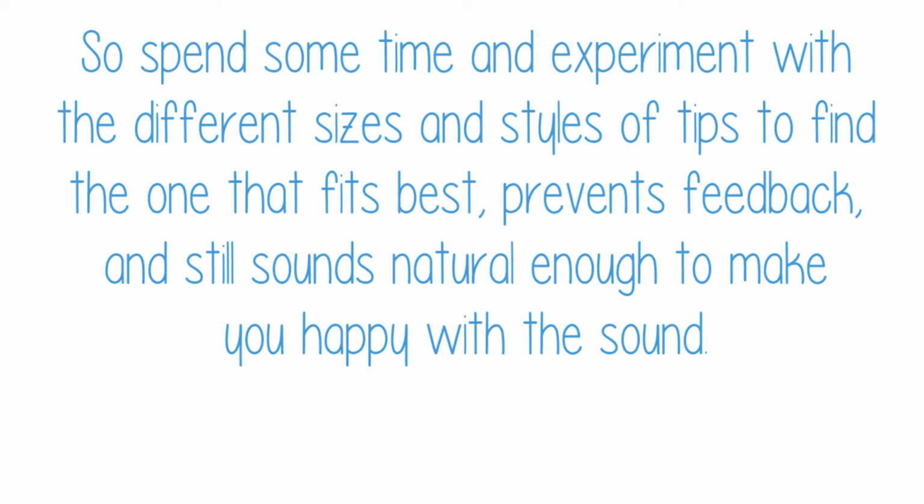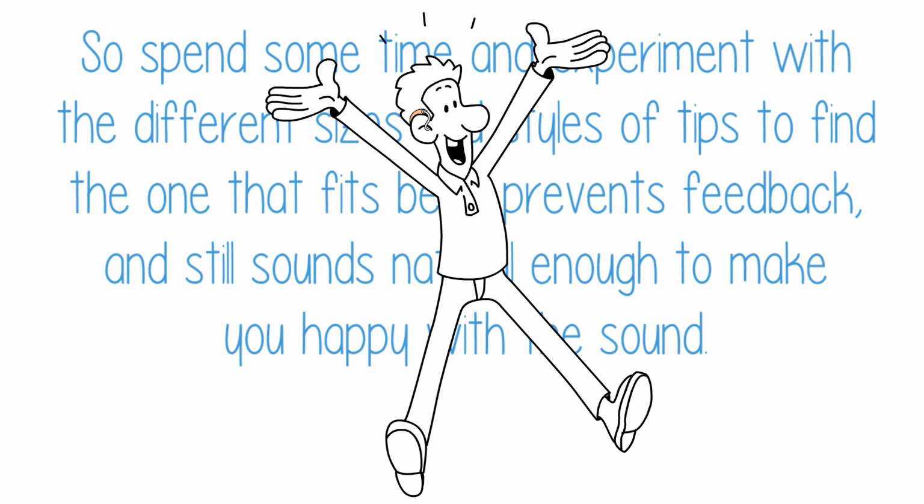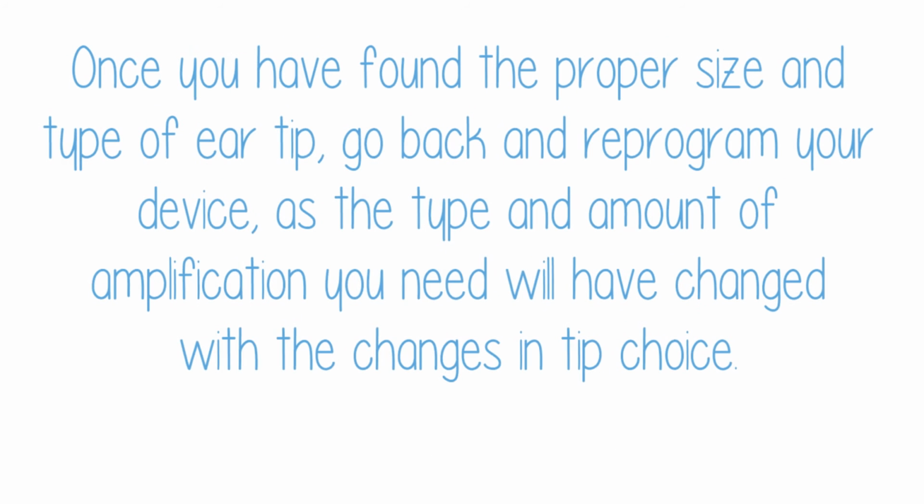So spend some time and experiment with the different sizes and styles of tips to find the one that fits best, prevents feedback, and still sounds natural enough to make you happy with the sound. Once you have found the proper size and type of ear tip, go back and reprogram your device, as the type and amount of amplification you need will have changed with the changes in tip choice.